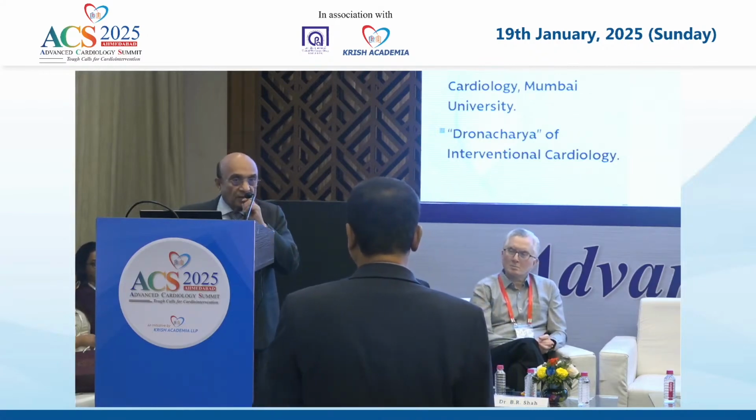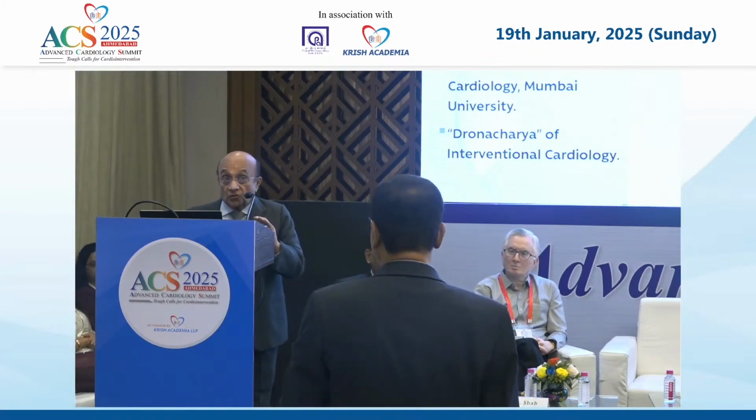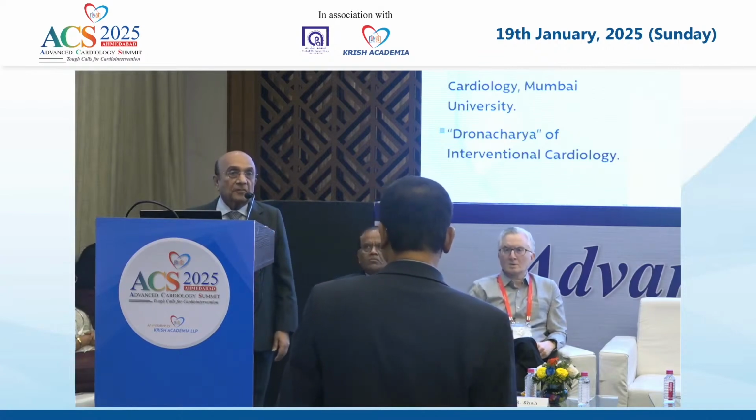Okay, now regarding your question. DCB in de novo lesions, we do not know, but Dr. Colombo, when he came in, I attended his lecture, he has a series now, and he has shown that DCB compared with the conventional treatment with the drug-eluting stent has been finding comparable results.